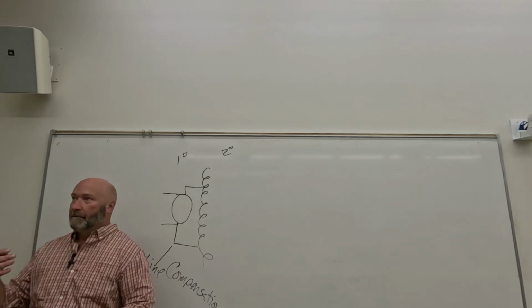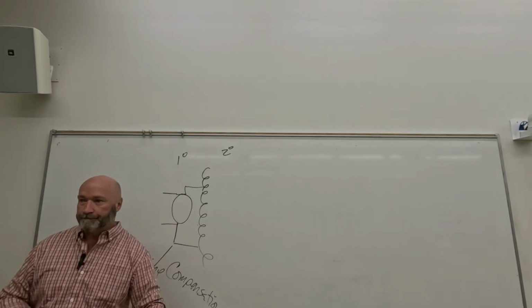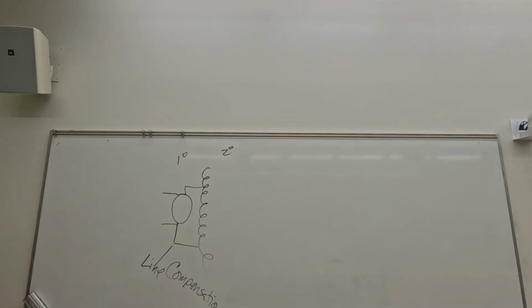We're not making mA until we actually have tube current. Okay, so mA and time together give us our quantity. It's just the number of x-rays, measured in milligray, and it's what we refer to as intensity. So at the control panel, we've got kVp, mA, time, focal spot size, which bucky we're going to shoot in, if we're going to shoot into a bucky at all, maybe shooting tabletop, which photocells, how much exposure, just everything, right? So that's our control panel.